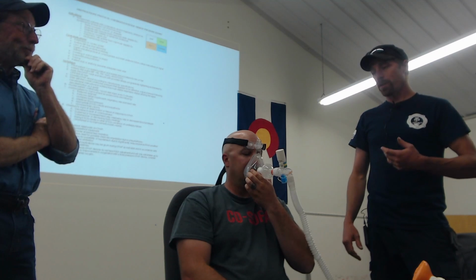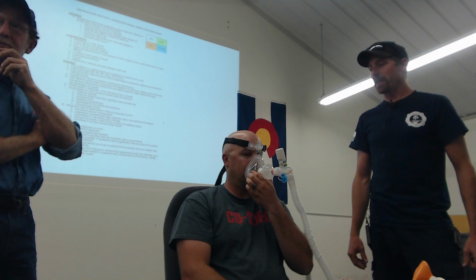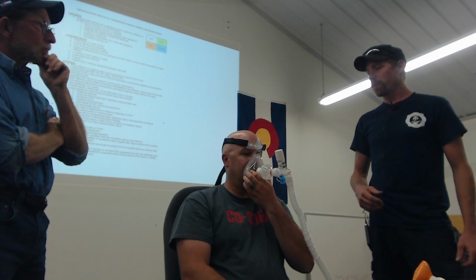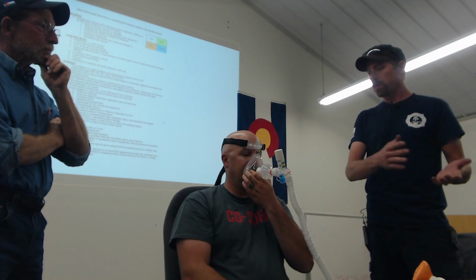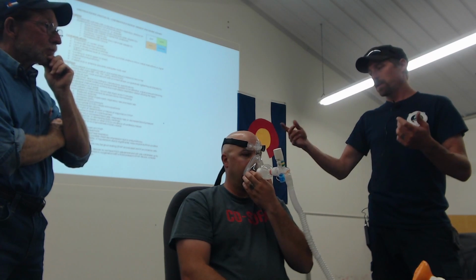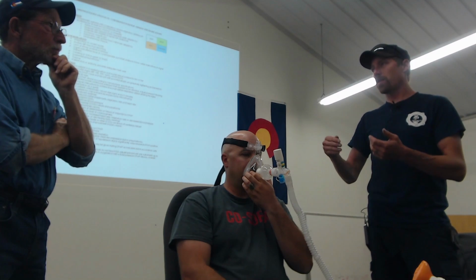Well, in general, when we start, my most concern is, are we tolerating the device itself? So I'm going to be looking for any signs of panic, are they getting agitated or anything like that? And if we need to reevaluate or go back to the non-rebreather for a period of time and try to work into this. Once we've established this and the patient's pretty comfortable, then we're going to start looking back towards the vital signs and the overall patient condition, if they had signs of cyanosis or something like that, or what were we seeing to initiate the CPAP? Are those things getting better?